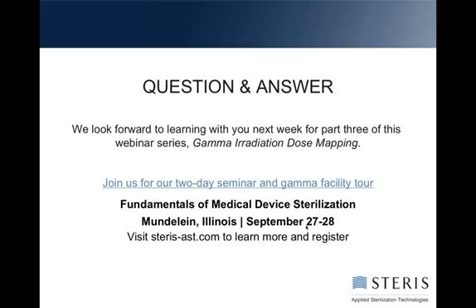You can test the endotoxin on the sterilized products. So for example, if you sterilize at 25 to 40, you can take samples out of your production run and test them for endotoxin. The reason you test every lot is that one of the largest contributing causes to the presence of an endotoxin in a product is a water supply.